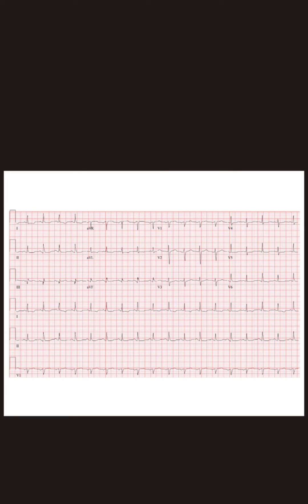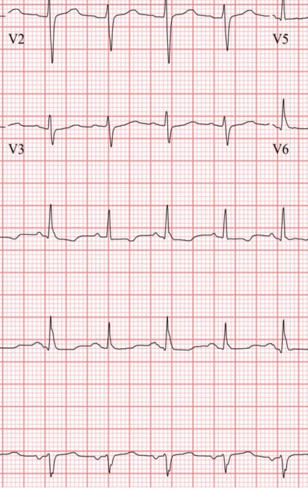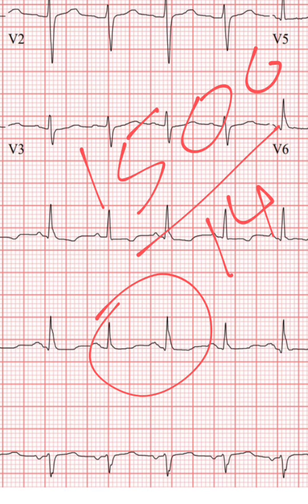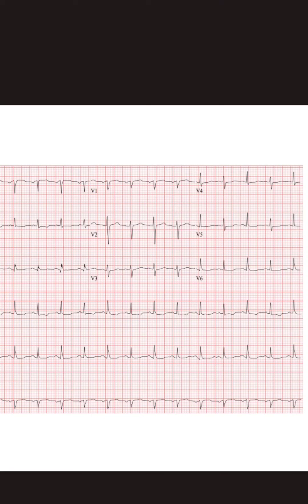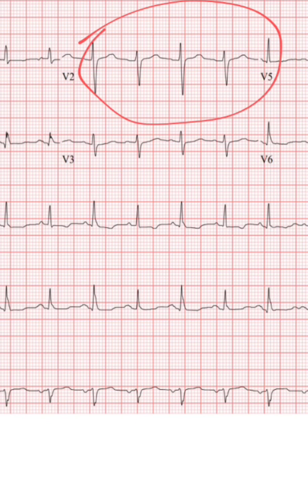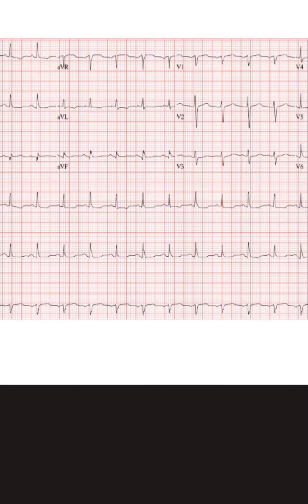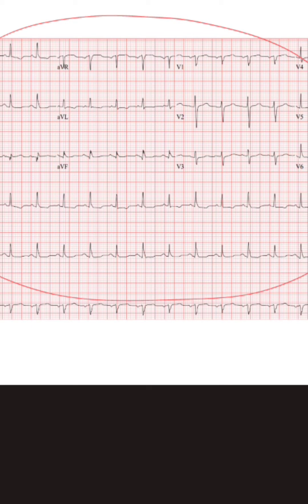Here is an interesting ECG. As you can see, there is sinus tachycardia, P waves are visible, electrical alternance is best seen in multiple chest leads, and the QRS voltage is diffusely low.